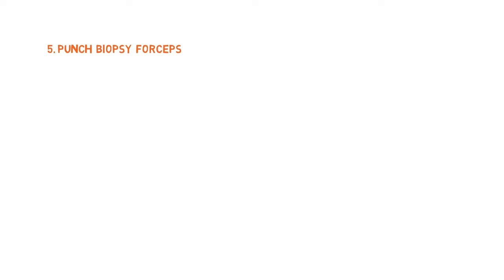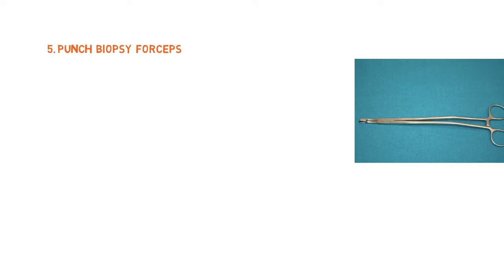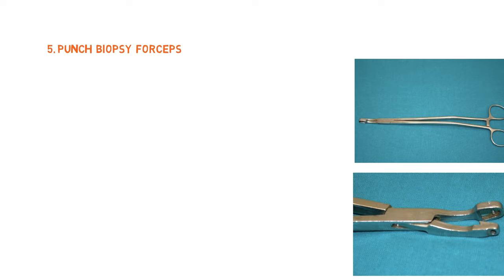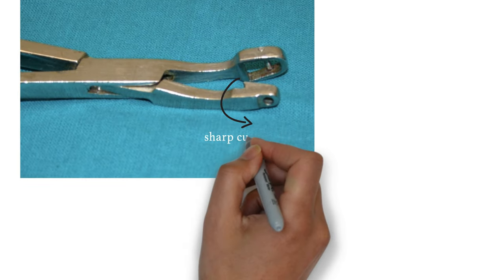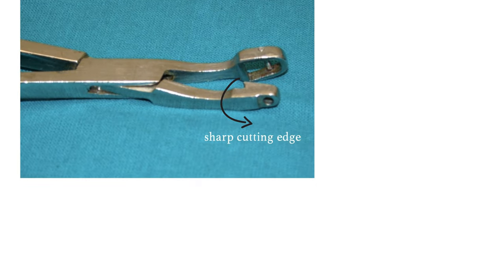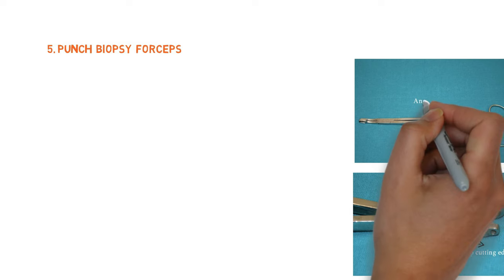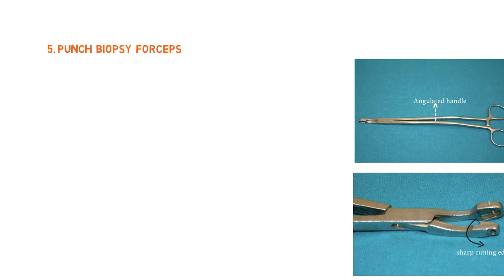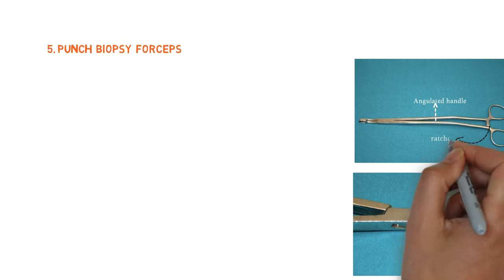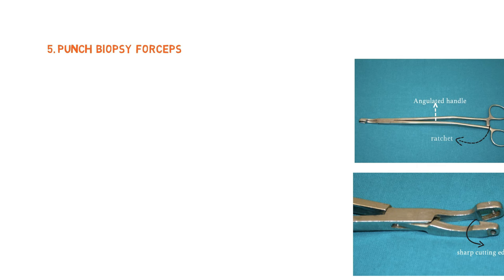Our next instrument is punch biopsy forceps. It is cup-shaped and has square jaws. The upper cup has sharp cutting edges and the lower cup holds the tissue. It has an angulated handle and ratchets with a cross joint, similar to the hemostatic forceps.